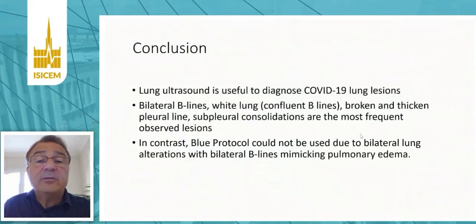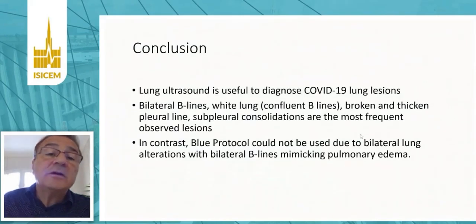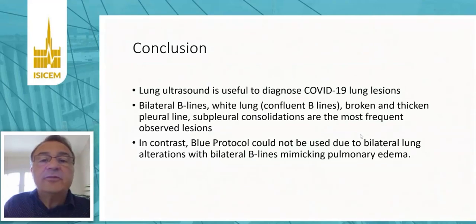So that's very interesting to analyze in our institution the accuracy of the BLUE protocol during the COVID-19 epidemic.